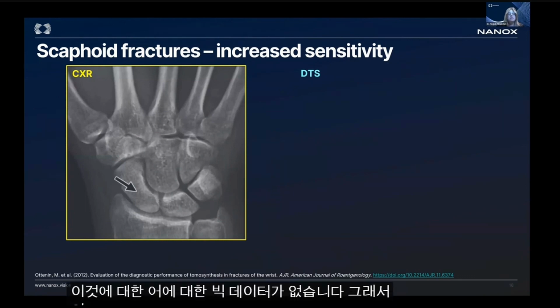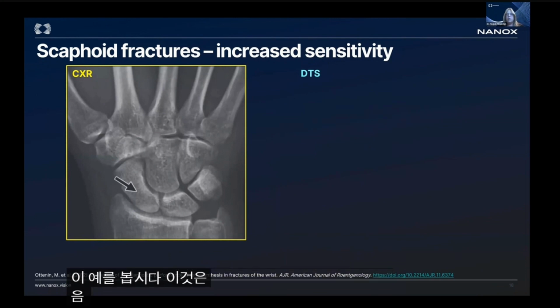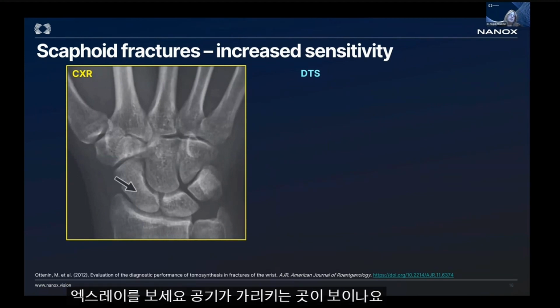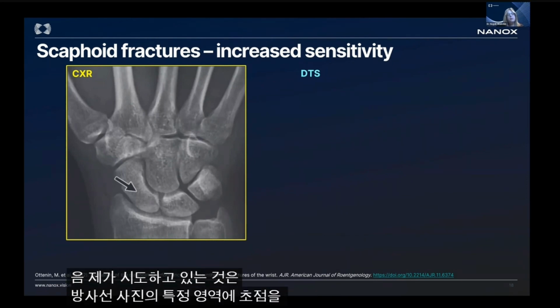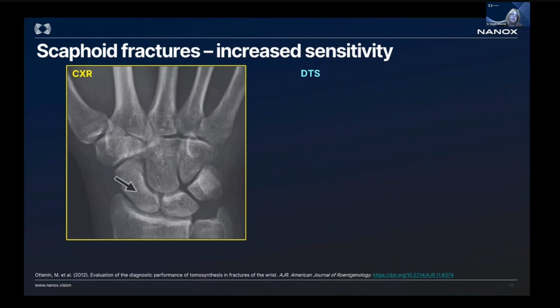So let's look at this example. This is taken, as you can see, from an article. And look at the X-ray. Do you see anything where the arrow is pointing? I'm trying to focus you on specific areas of the radiograph, and just look at it for a second.